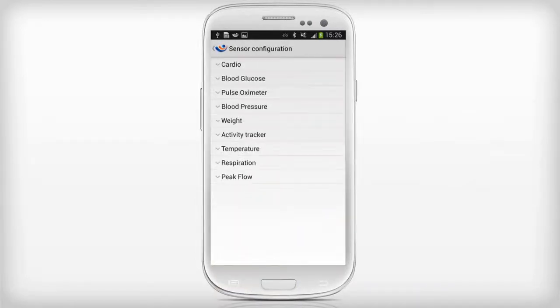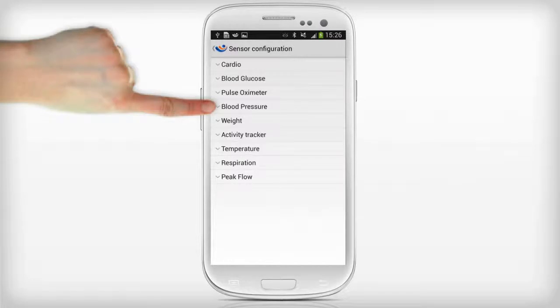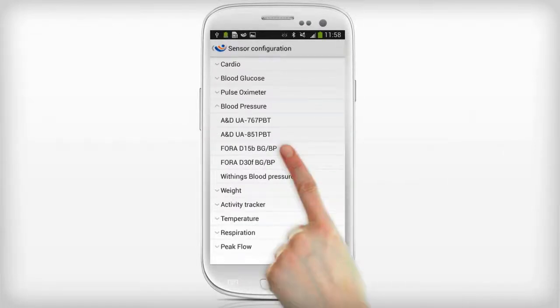In the Sensor Configuration menu, select Blood Pressure, then select the Fora D15B sensor.